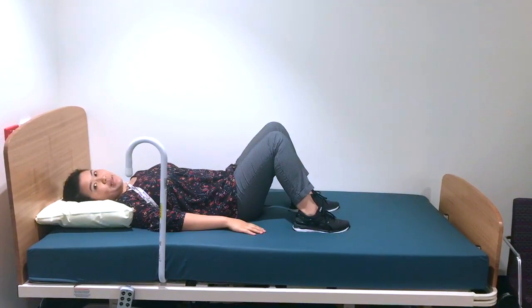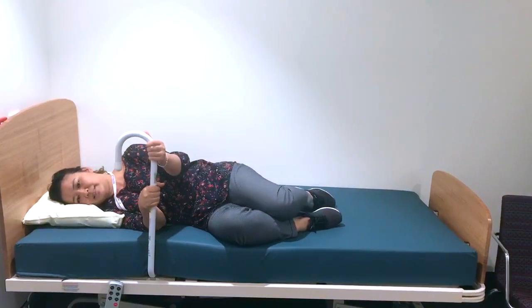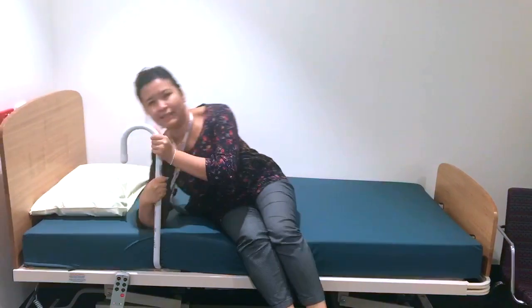To get out of the bed, you use the same procedure. Roll onto your side, hold onto the bedstick, swing your legs down, and push off using your elbow and the bedstick as leverage.